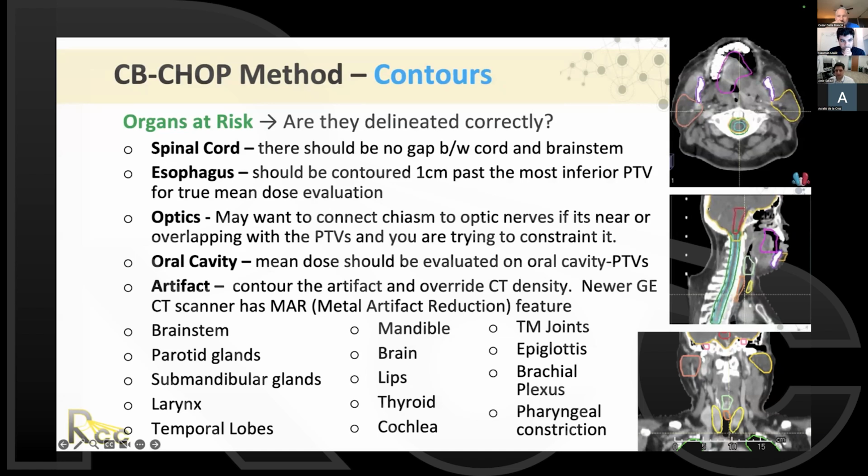I completely agree with Dr. Malik. I think there are a couple of OARs that there is always some controversy about how to contour well. And there has been a recent thread on Twitter that substantiates some of my peculiarities. For example, with the parotid glands, often there's some debate about how anterior you should contour them, whether you should begin to include some of the ducts. With the oral cavity contour, sometimes the floor of the mouth is missed. And so you want to be careful about these structures because, as Dr. Malik said, if they're not contoured and optimized to, you can't improve the planning to improve the side effects. And so you always want to interrogate these closely, even though they're just organs at risk.